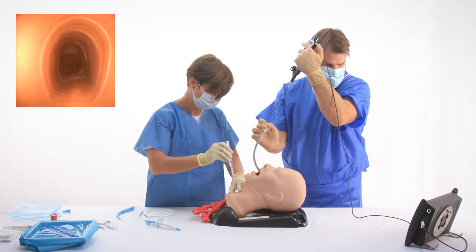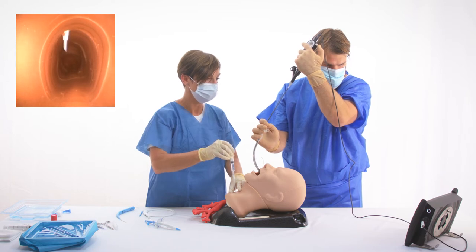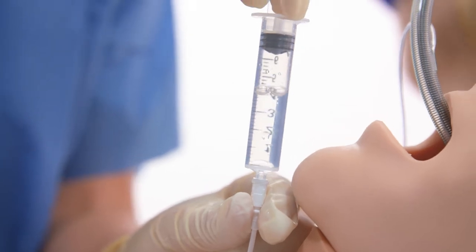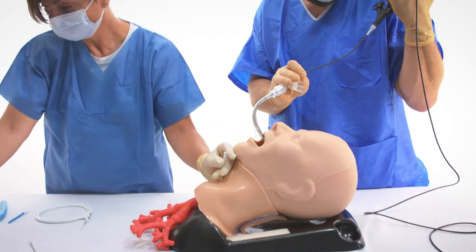A syringe half filled with fluid and attached to the introducer needle is introduced into the trachea under bronchoscopic control. The outer FEP sheath of the introducer is then advanced while the needle is removed.